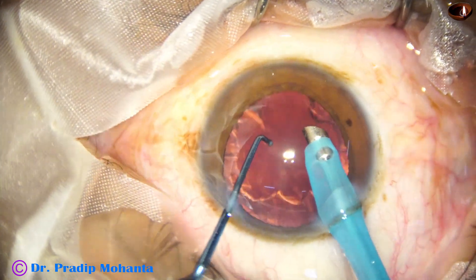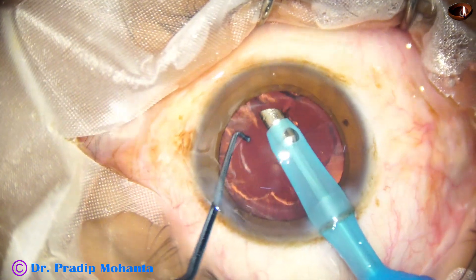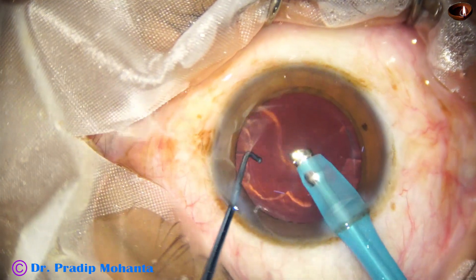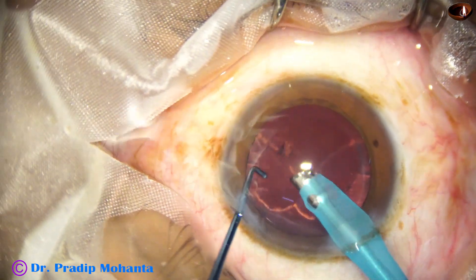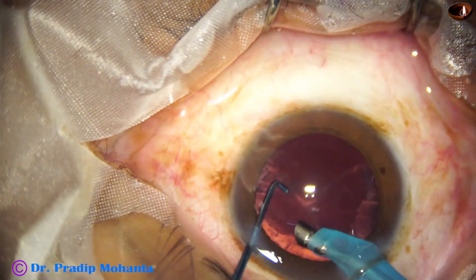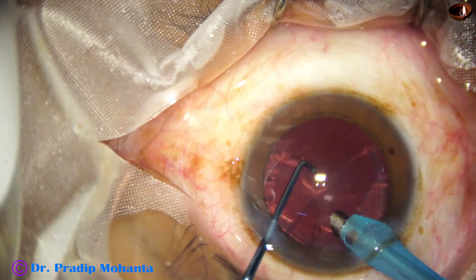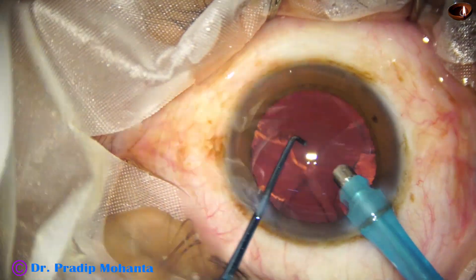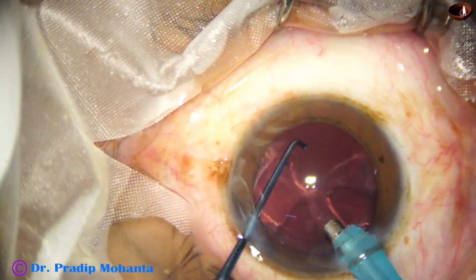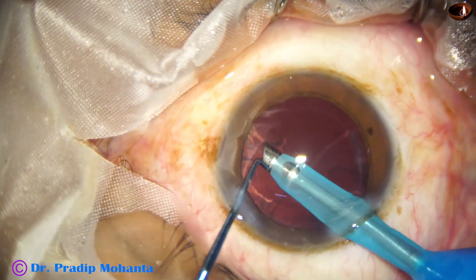And now I use the handpiece itself to remove some cortex. This has some learning curve, and if your intuition says that this step is dangerous, do not do this. So let us just use safer ways of cortical aspiration. You can use bi-manual IA, coaxial IA, or Simcoe cannula.